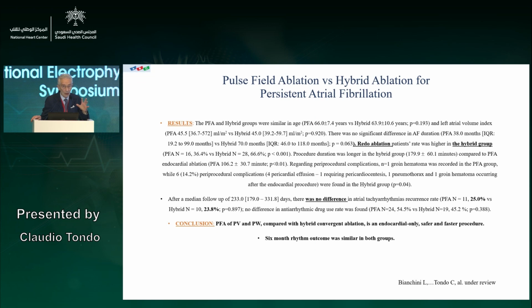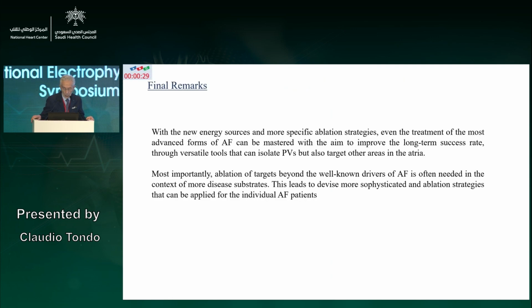So I think this is one of the reasons why PFA can be the real new avenue for treating patients with posterior wall involvement.